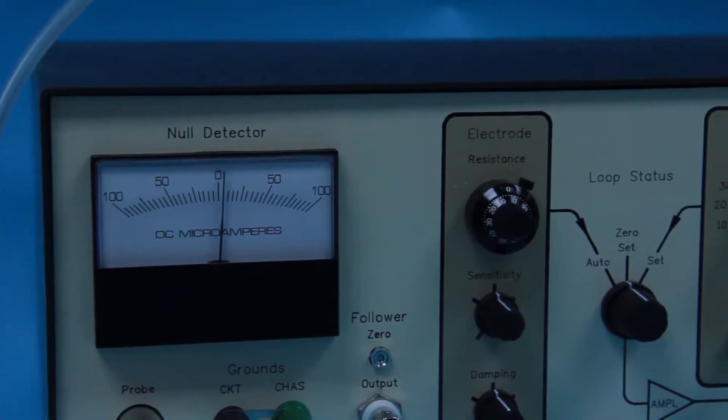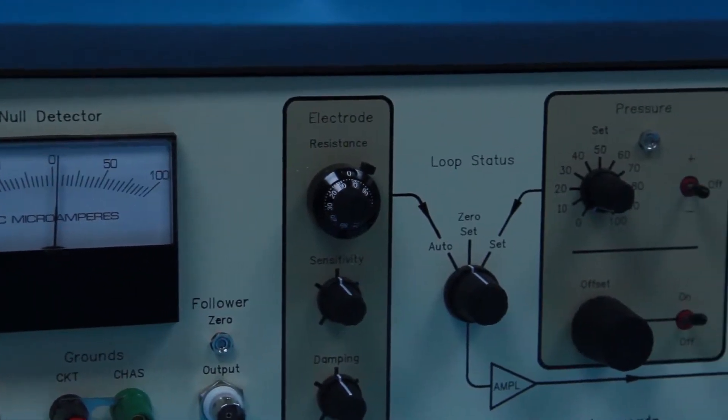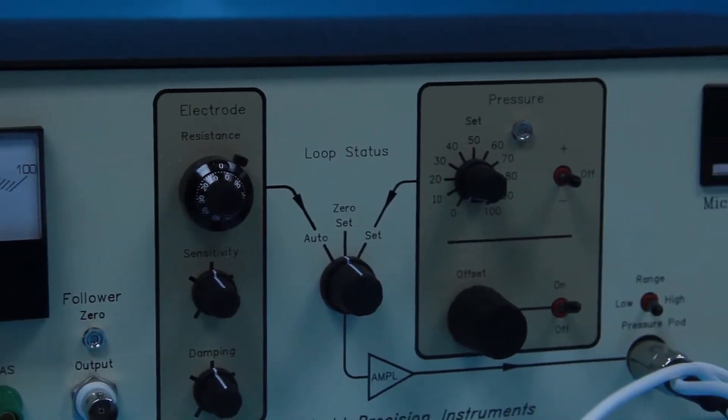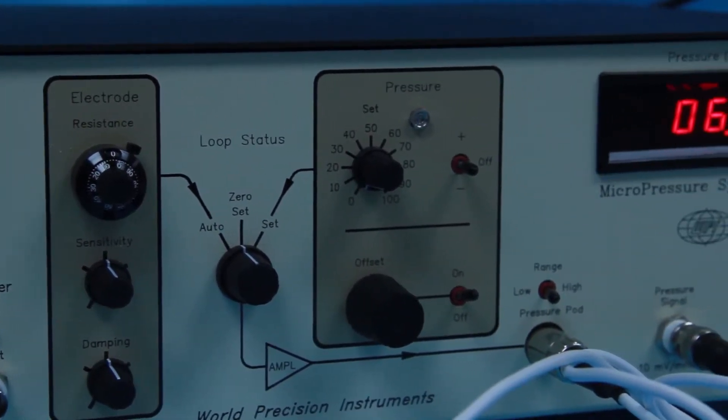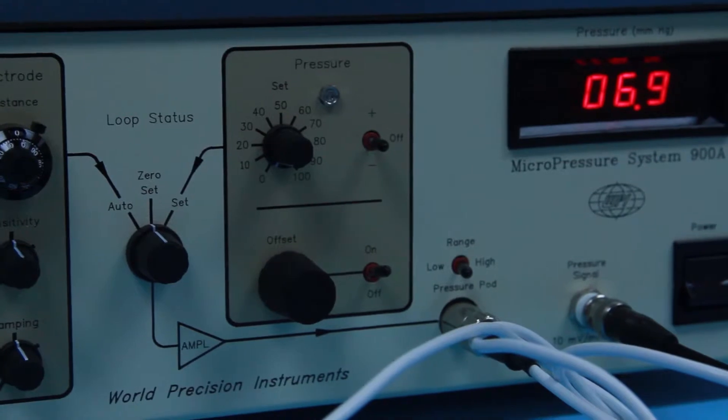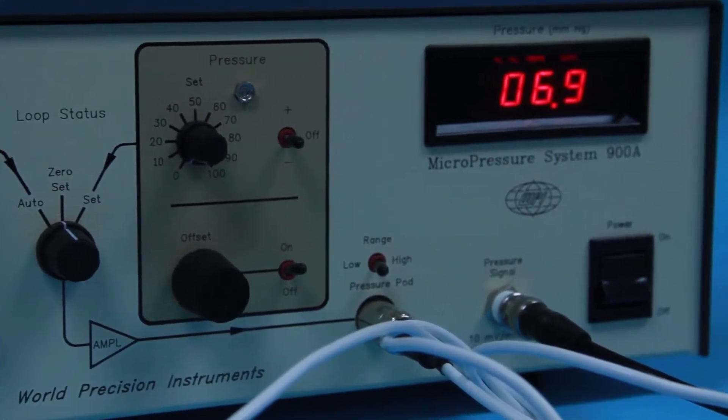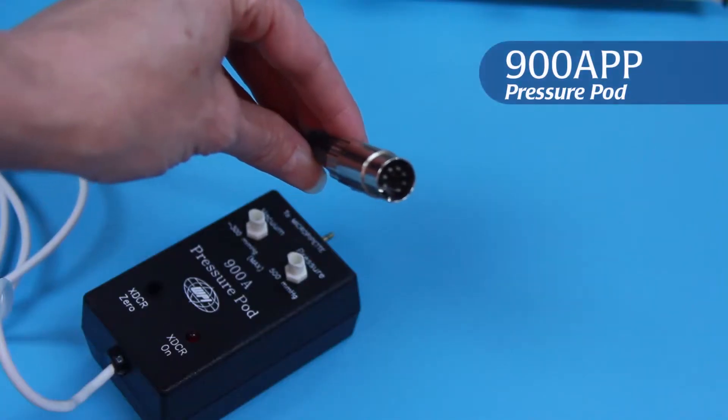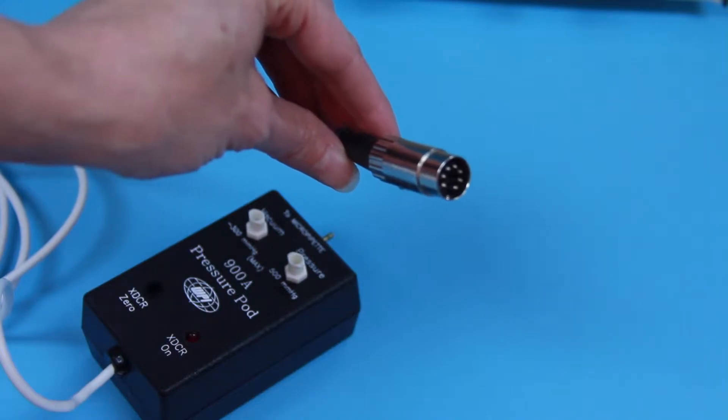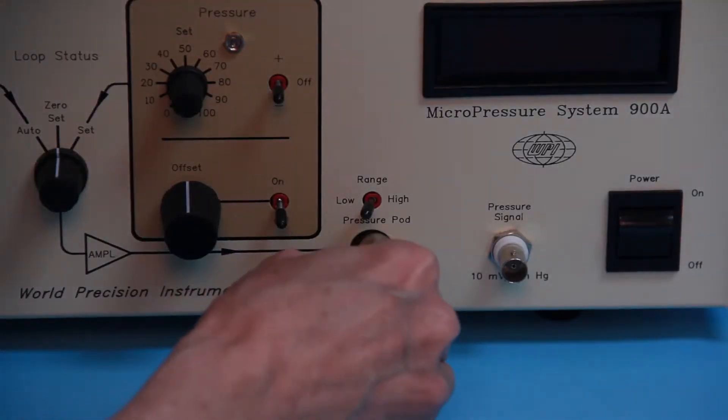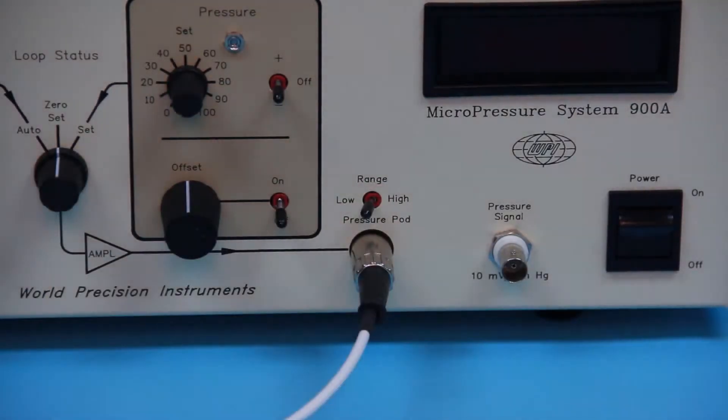WPI's model 900A micropressure system is designed to measure pressures from minus 200 to plus 400 millimeters of mercury in small blood vessels, cells, and other electrolyte-filled microcavities. Connect the 7-pin cable on the pressure pod to the connector labeled pressure pod on the front panel of the control unit.